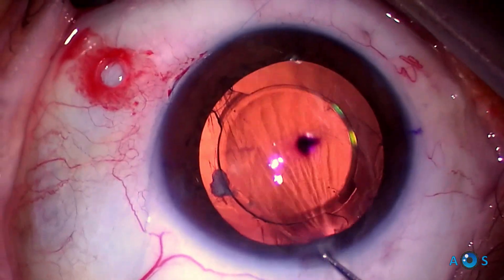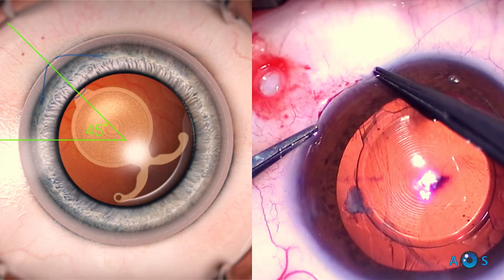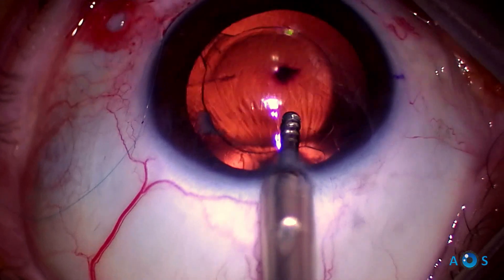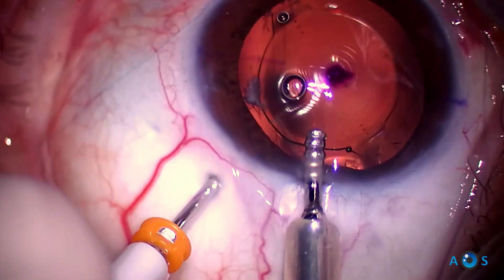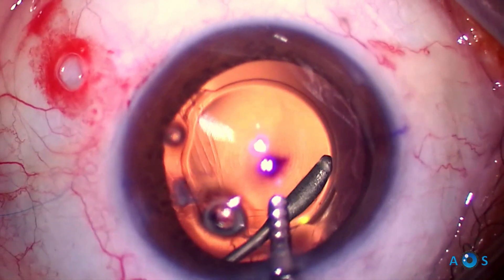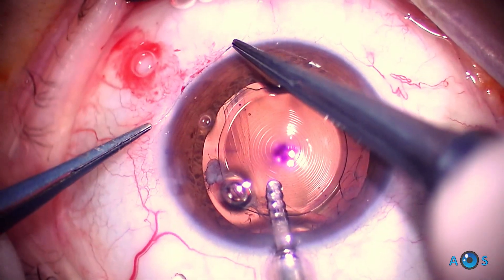The double-armed 10-0 prolene suture thread has created a looped fashion support at the haptic root. In this premium IOL, the haptic root and toric axis are coincident, so the IOL is now aligned at the originally intended axis.